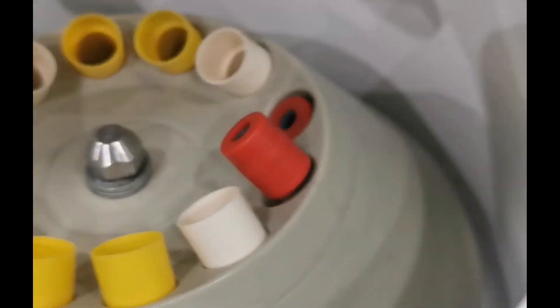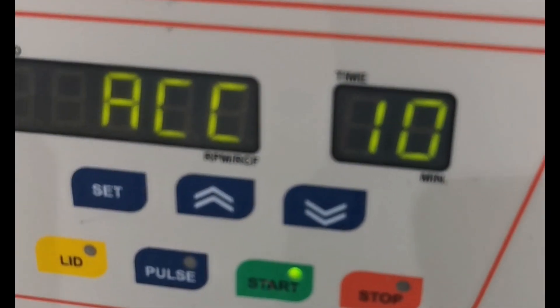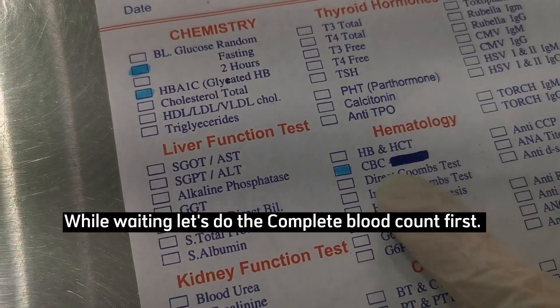With blood collected, centrifuge the red top tube for 10 minutes to get the serum. While waiting, let's do the complete blood count first.